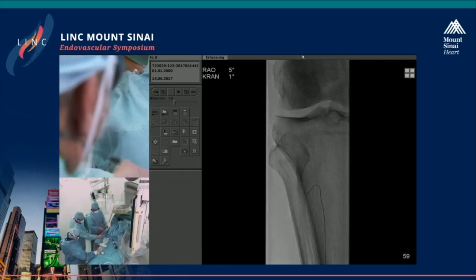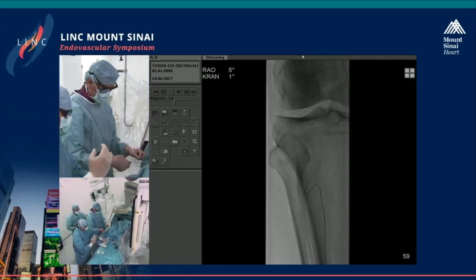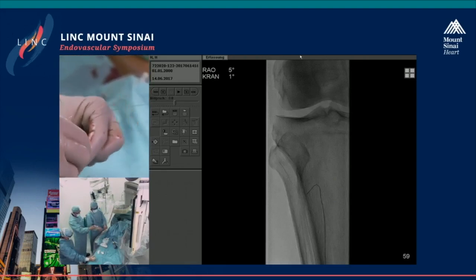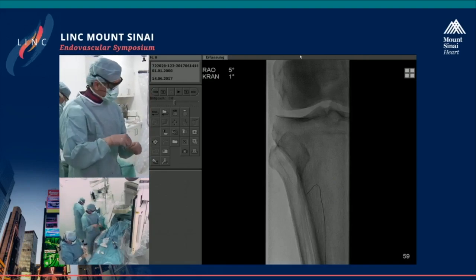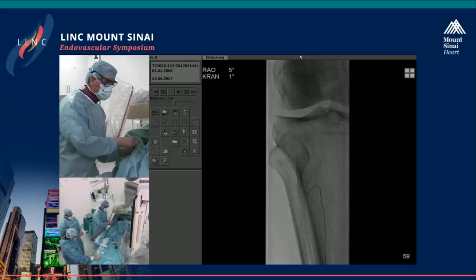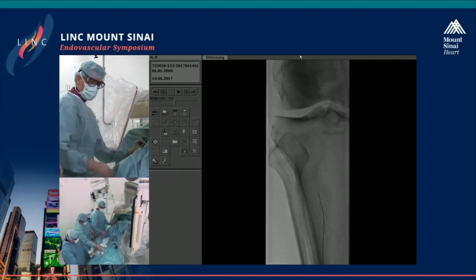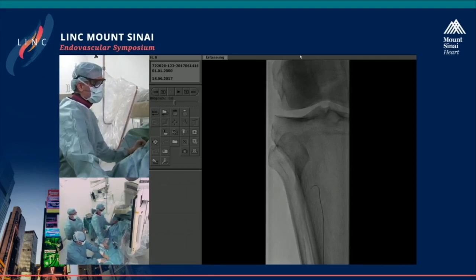Yeah. But over the time and experience, we also checked our cases during follow-up where we inserted this 2.9 French sheath. And we had an eye on whether we would damage here the artery over time, induce a restenosis or something. But we haven't seen anything, as we haven't seen with the sheathless approach. So at the end, yeah, we are more confident, and it becomes a little bit more our standard technique here than in the past to go directly with a sheath in.